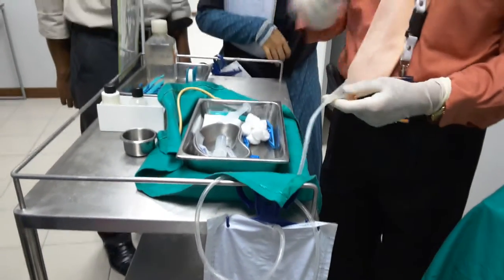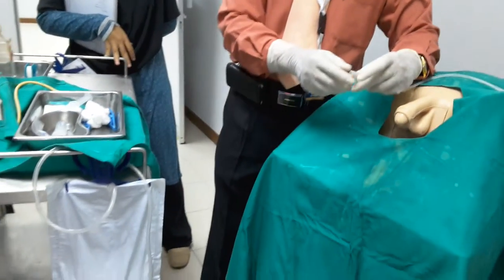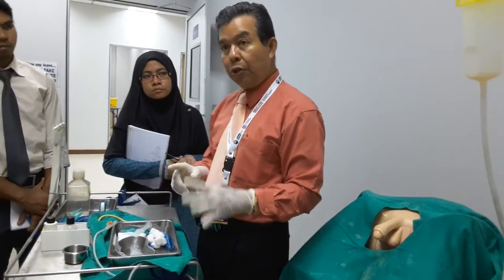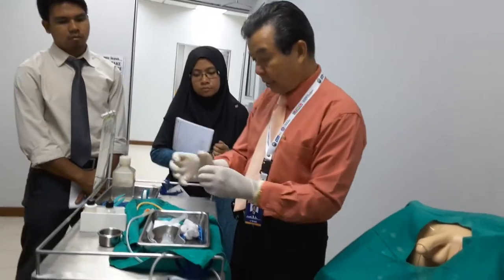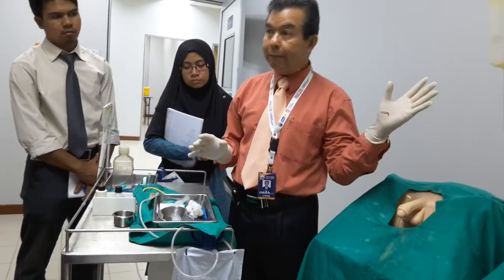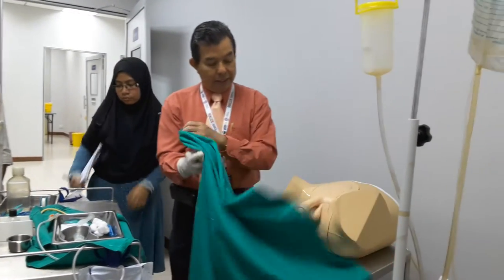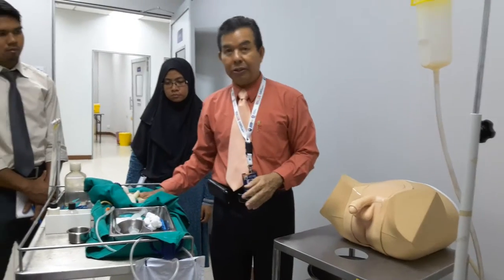The balloon keeps the catheter secured inside the urinary bladder and urine drains through to the collection bag. In the ward, the container measures urine output to assess whether it is adequate. Remember the aseptic non-touch technique for putting on gloves and handling everything. Once done, wash up, cover up, and thank the patient. That is catheterization.